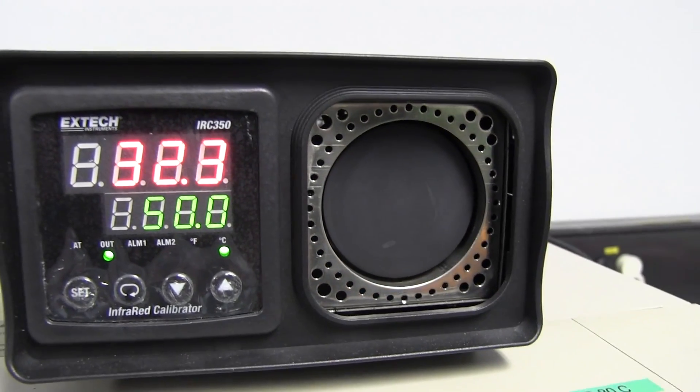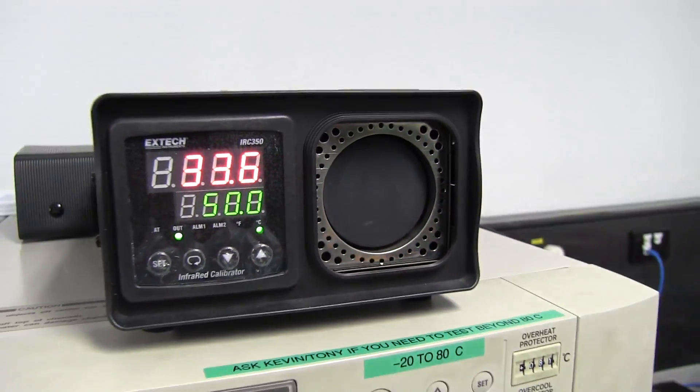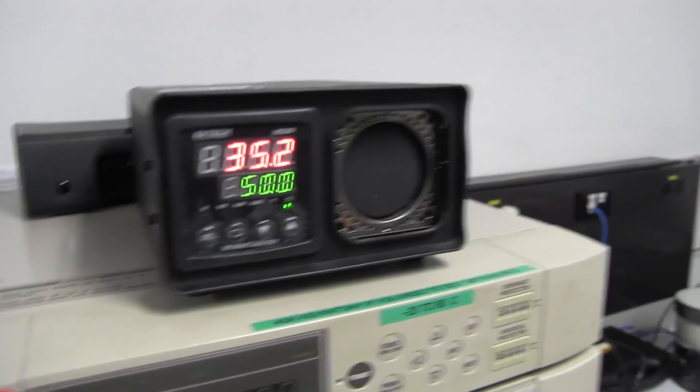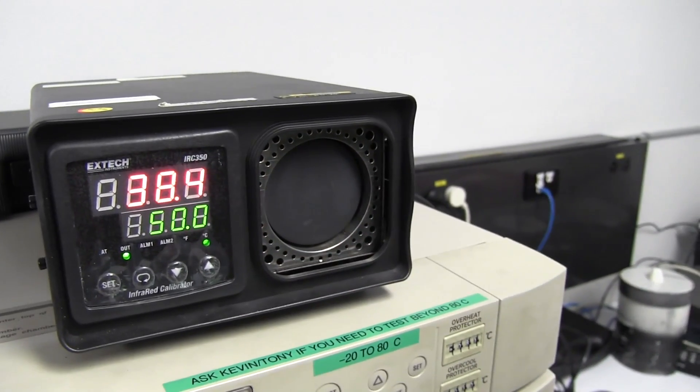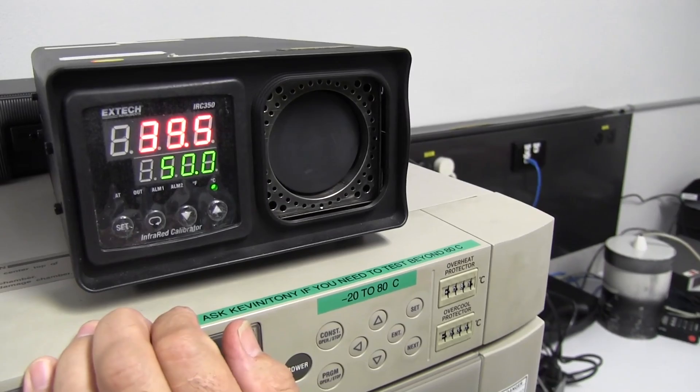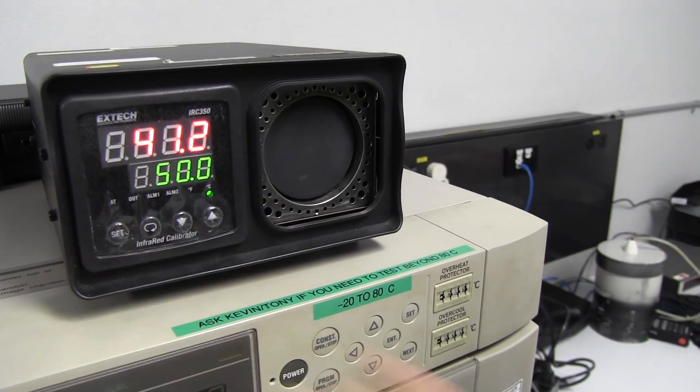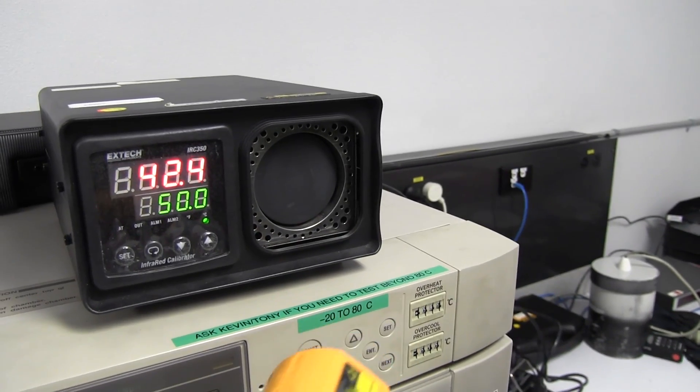While I'm here I thought I'd check it out and calibrate it. He's got one of these X-Tech IRC 350 black body radiation units. Can you tell us about it, Charles? You've got a very high emissivity area here, and this one's set at the moment to get to 50 degrees.